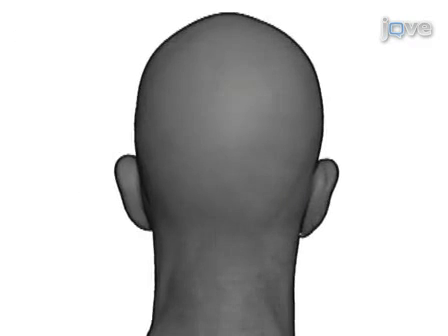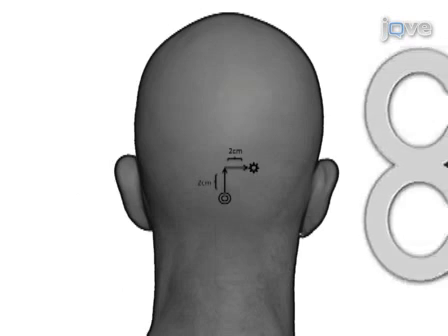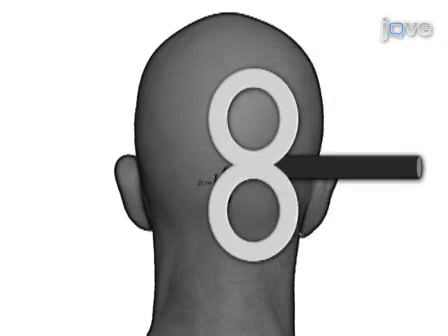The location of the initial point of stimulation is first identified. The center of the TMS coil is placed over the point of stimulation so that the handle is tangential to the surface of the scalp.